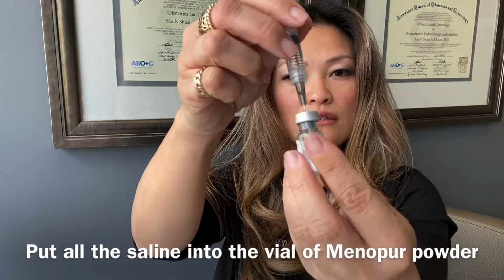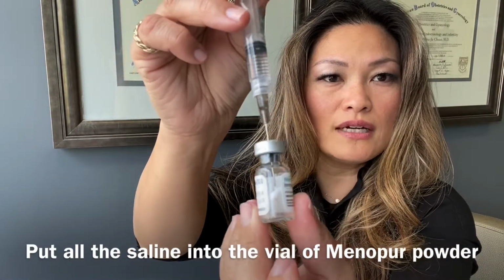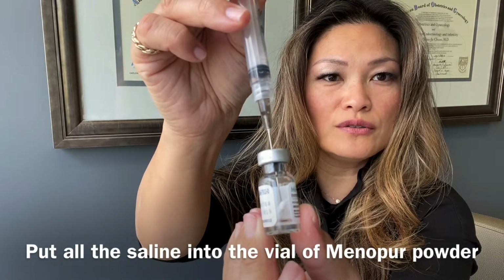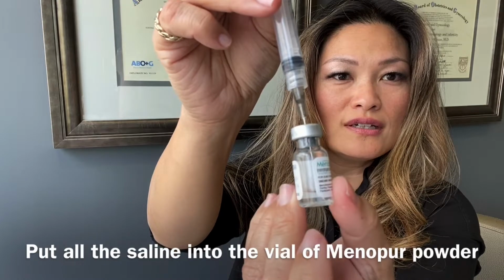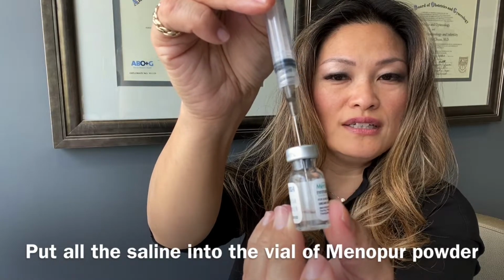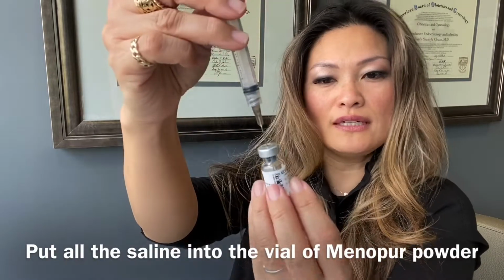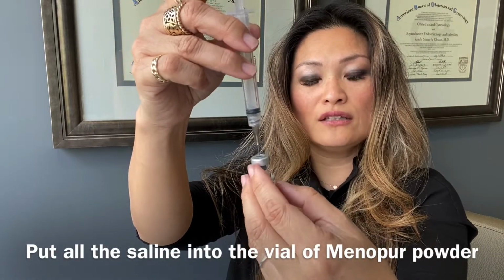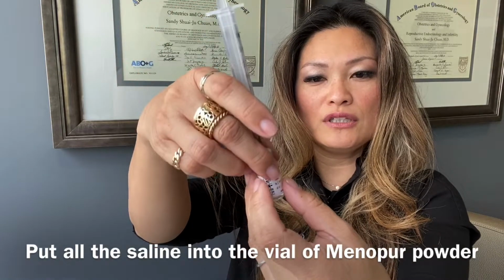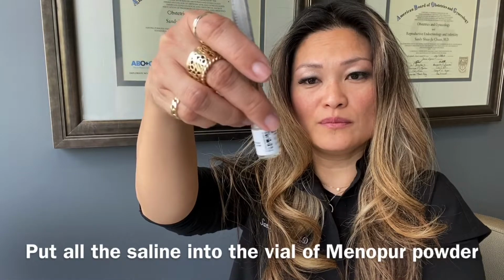Then you put the needle in, and there'll be a little bit of suction. Sometimes, see how I'm pushing the fluid in? Okay, and see how that dissolved really quickly? So you inject your fluid in there, and then you want to take a look at it, turn it towards yourself like I'm doing. If there's any powder that looks like it's not dissolved, you can gently swirl it like this. Okay, you don't want to shake it because you don't want there to be any bubbles.